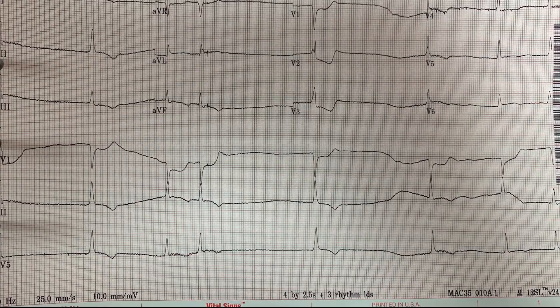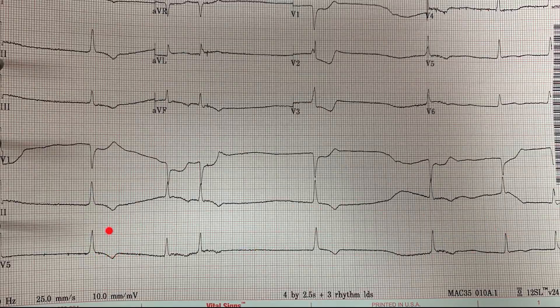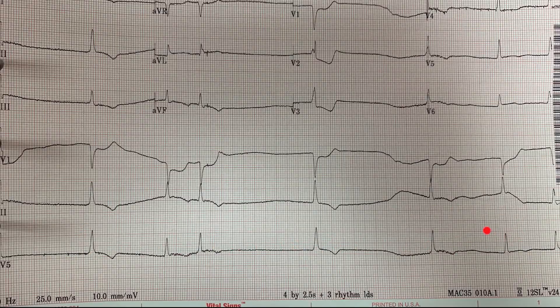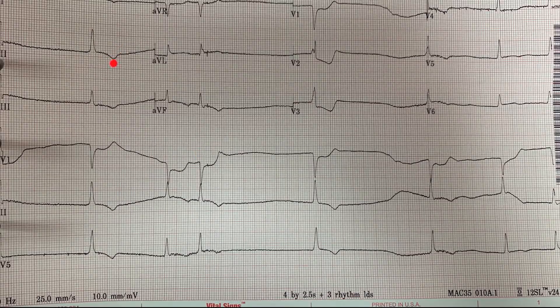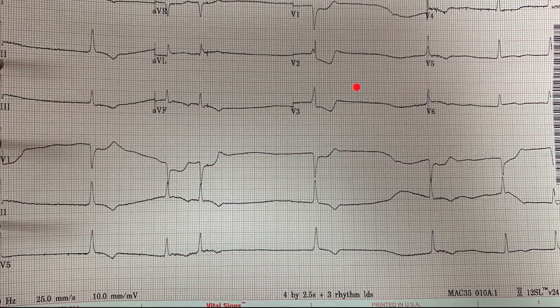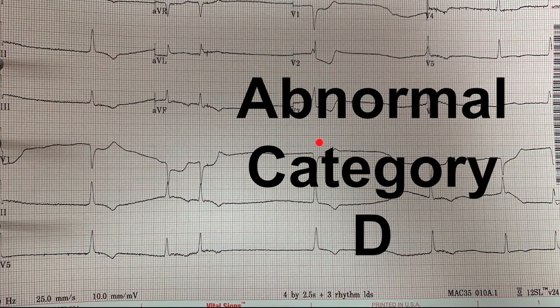The final EKG is clearly abnormal for multiple reasons. The heart rate is very slow and irregularly irregular, with no clear P-waves — most likely this patient has underlying atrial fibrillation, possibly with medication-induced profound bradycardia. The QRS complexes are wide. There is T-wave inversion in multiple leads and profound ST depression in V1, V2, and V3. This pattern suggests medication toxicity — possibly digoxin toxicity or something similar. This is a Category D EKG requiring immediate attention and intervention.